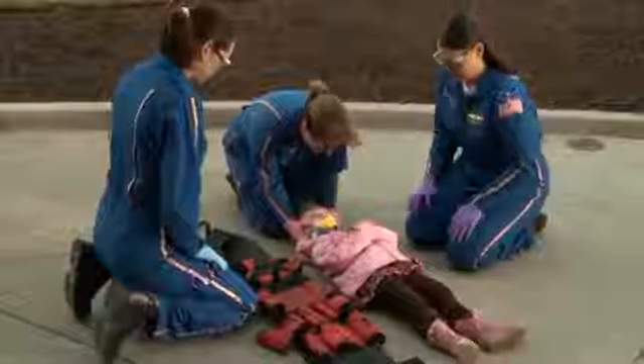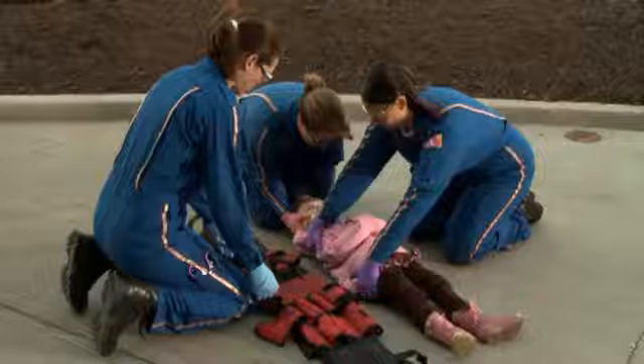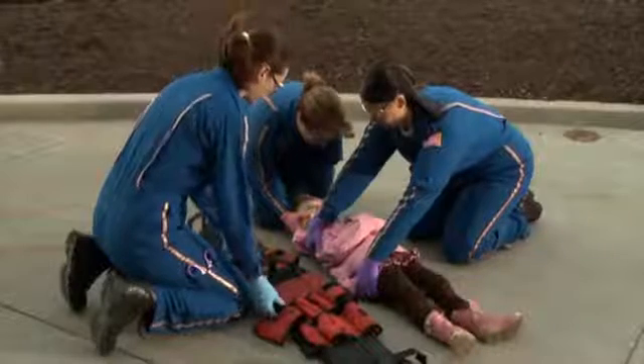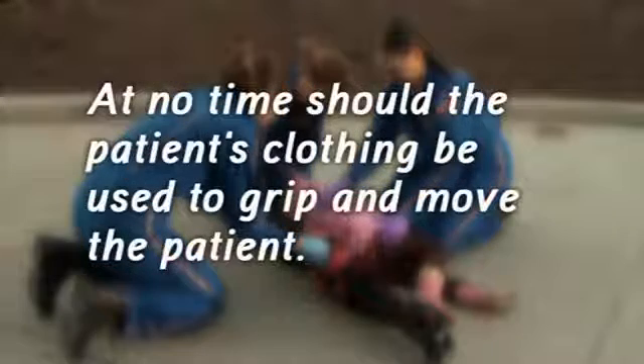Once in place, the second provider reaches over the patient and places one hand under the patient's shoulder and the other hand under the patient's hip. On command from the first provider, the patient is rolled onto their side facing the second provider. At no time should the patient's clothing be used to grip and move the patient.